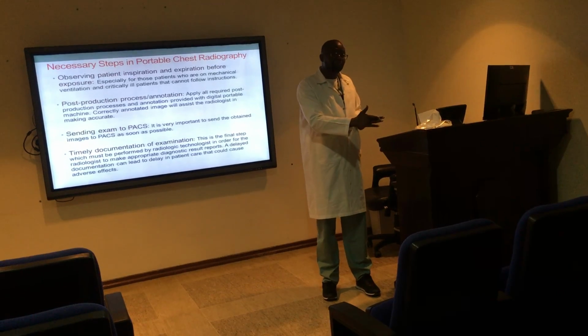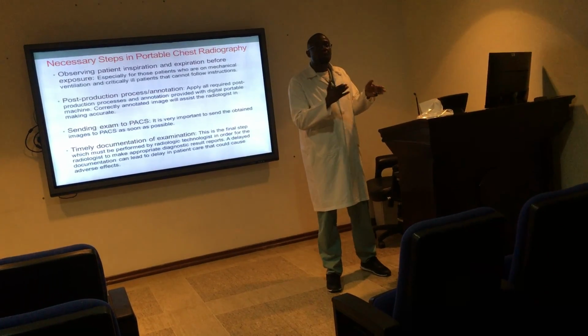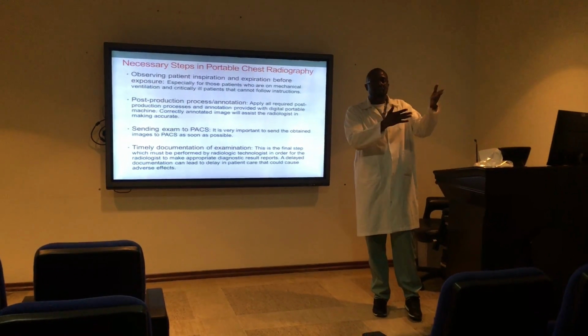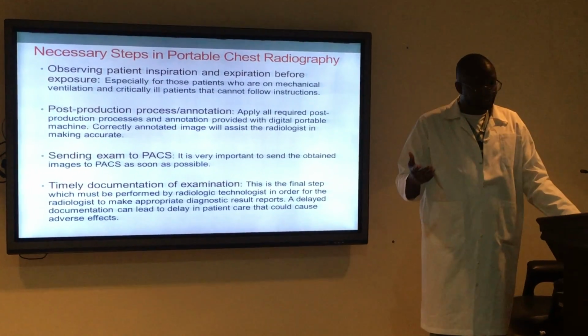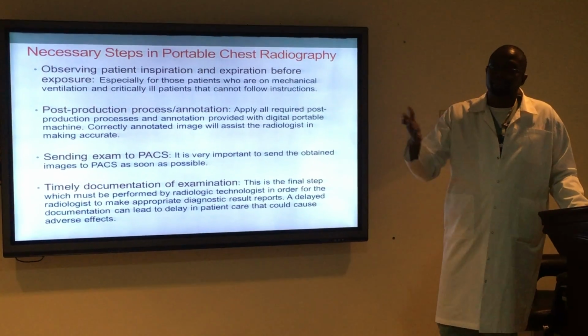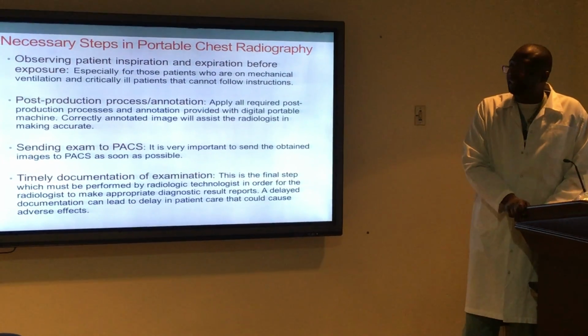Until you do this, you cannot go to the next step of documenting your examination, which will give the other areas in the hospital access to view the image for our radiologists to make the necessary report regarding the exam.